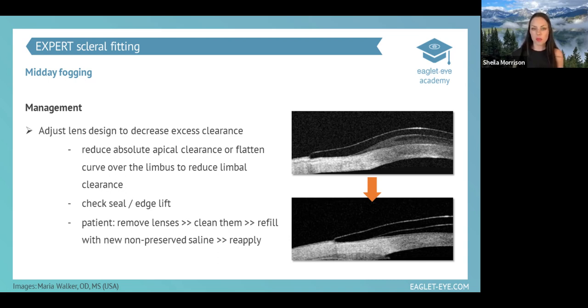Midday fog can also be remediated in a lot of cases by the solutions that we use. So once we get a great lens fit without excessive limbal clearance, we make sure there's no edge lift that's allowing external debris to get under that lens. Then we usually take a look and think about things like allergy. So often I'll put patients on allergy drops or an antihistamine.